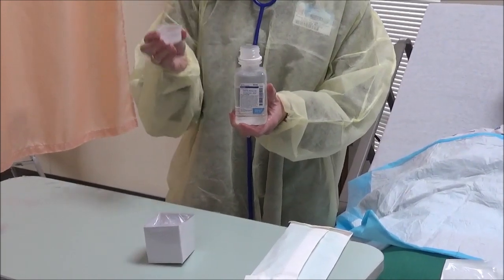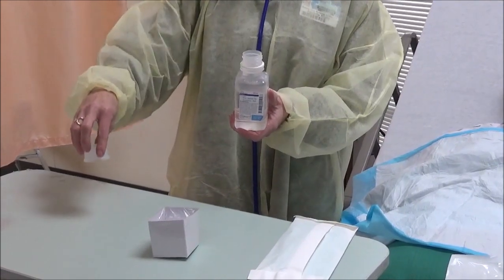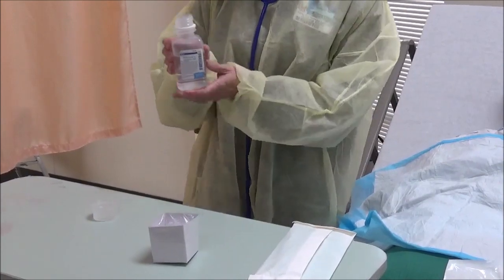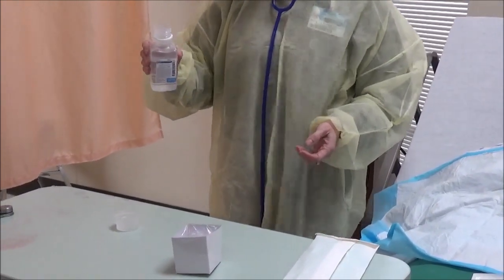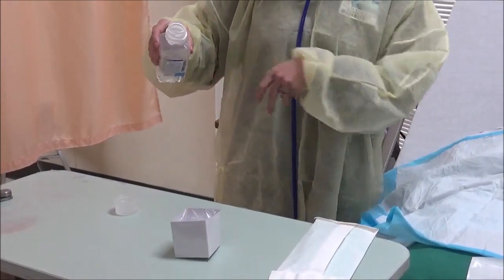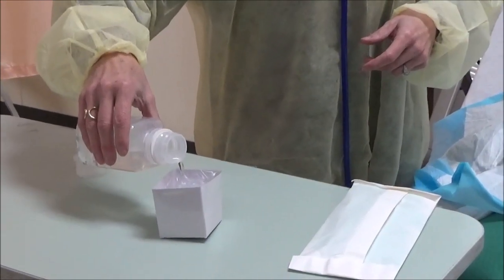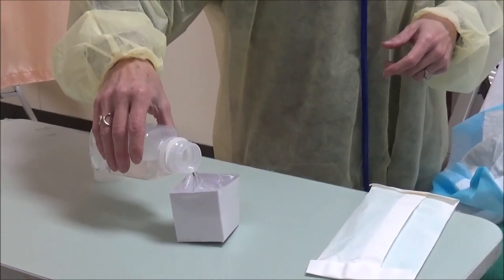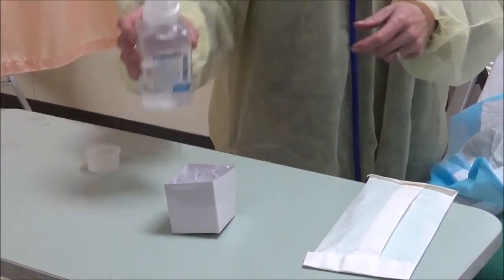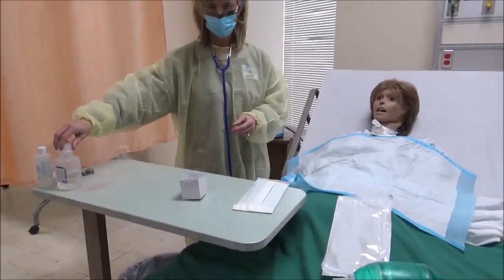I'm going to open this. If I set the cap down, I need to make sure that I set the cap up so it doesn't become contaminated on this liquid. I'm going to lip into my garbage, because the purpose of lipping cleanses any debris that's there. And I will come and pour the solution in my box. And the weight of the water should allow that plastic to collapse down. And then I'm finished with this.